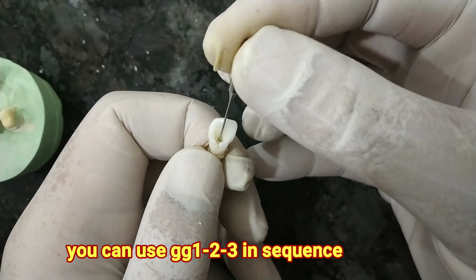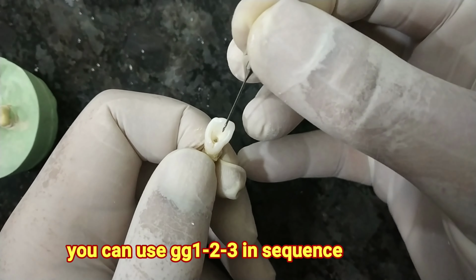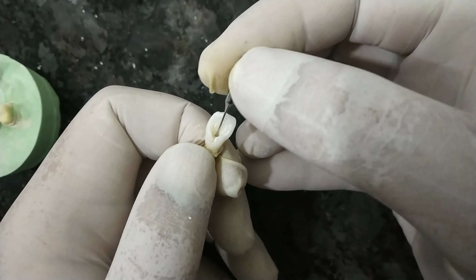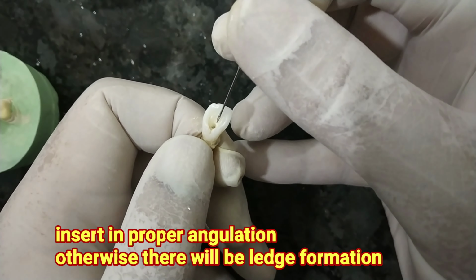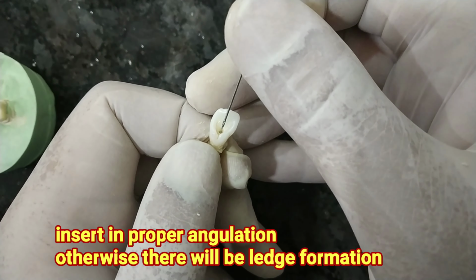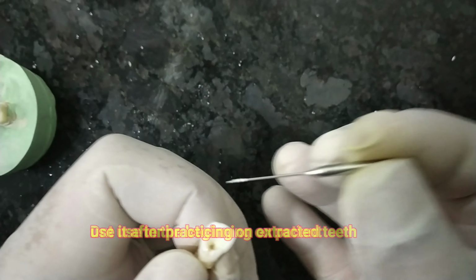So just like that, you have to make the entry only till this point, only just where the drill is there. If you enlarge it totally inside, it may cause ledge formation. So just remember, using the fingers very slowly, finger rest, just insert it a little bit and just take it out. So this is the use of the Gates Glidden drill.